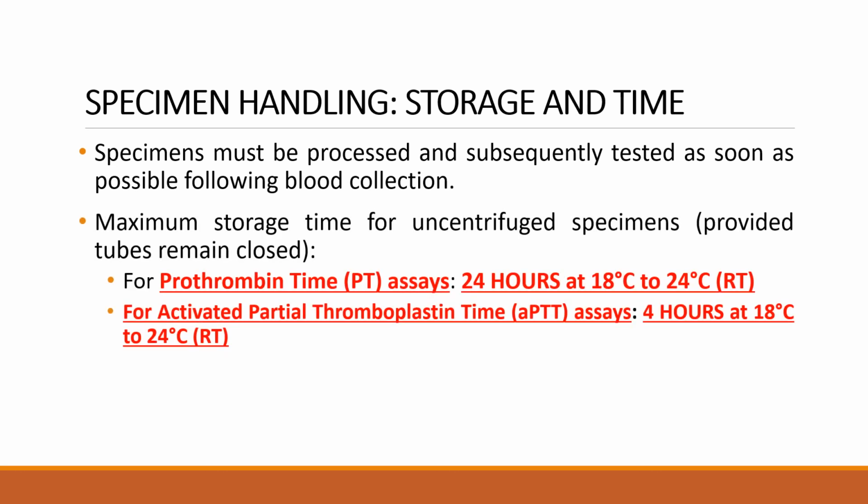The maximum storage time for uncentrifuged specimens, provided that the tubes remain closed: for PT, the prothrombin time assay, storage time should be 24 hours at 18 to 24 degrees Celsius, so that is room temperature. And for APTT, that is 4 hours at 18 to 24 degrees Celsius.